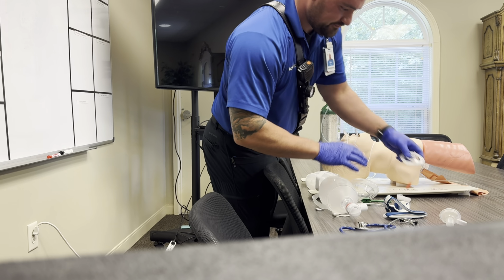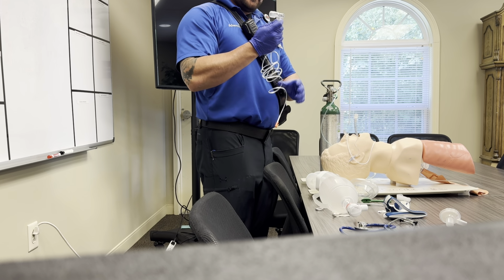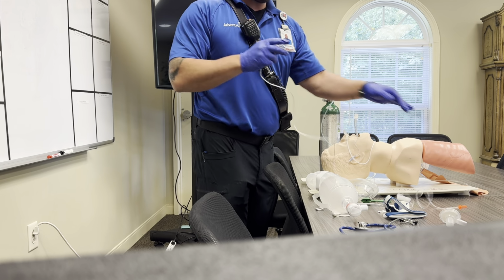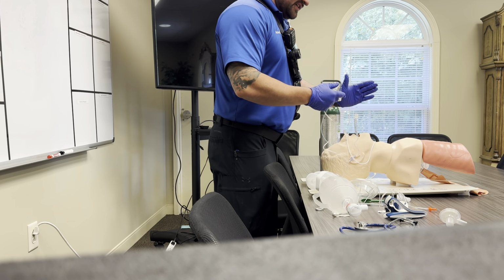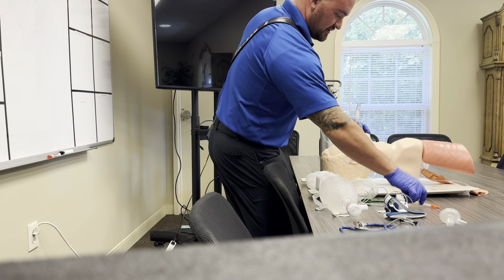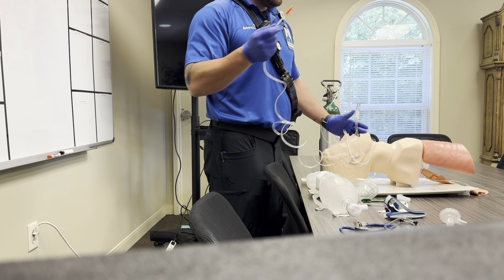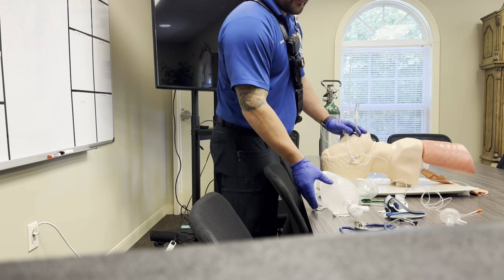Number two, and what is probably the most correct, I would say, maybe correct's not the correct word, but the best way of verifying other than direct visualization would be end-tidal CO2 monitoring. These go directly on the hub of the tube and they plug into our monitor. We use LifePak 15s. These plug directly into the LifePak and give us a nice CO2 reading.